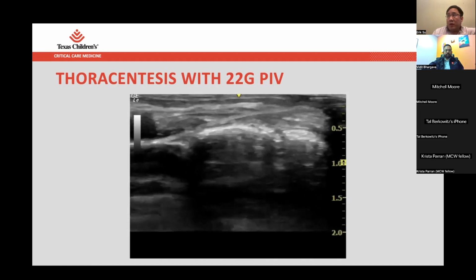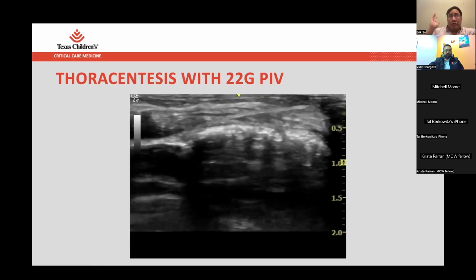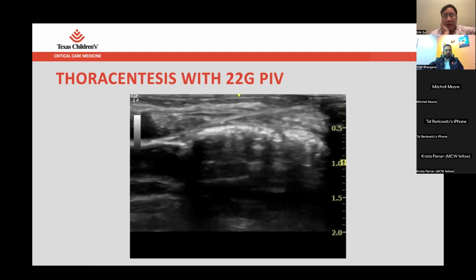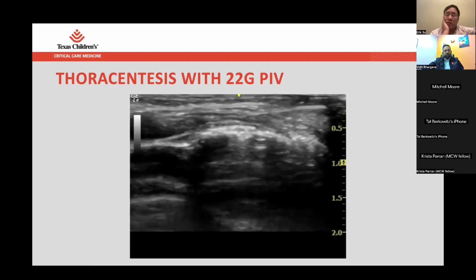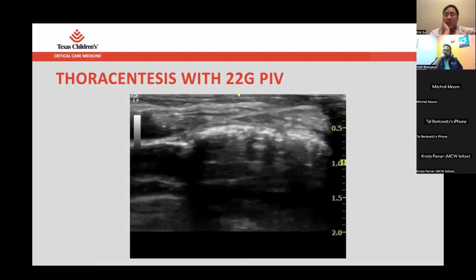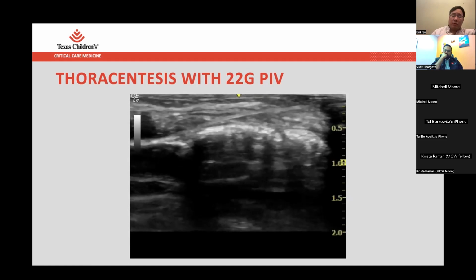But then with the larger pleural tube dilator, like a regular Furman pericardiocentesis kit, you put the dilator in place. You can even watch it under ultrasound to make sure you don't puncture too far, but usually the wire is going to be somewhat protective about that. You're always going to be really careful in this situation. And then you just switch it out to a pleural drain.